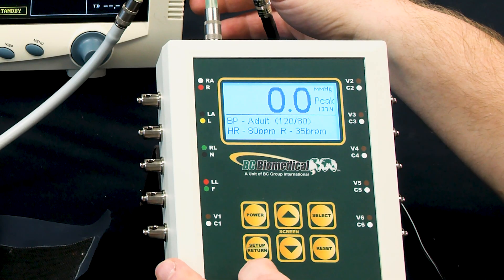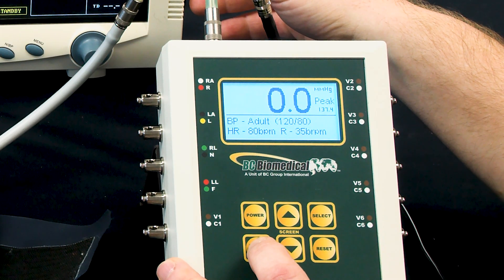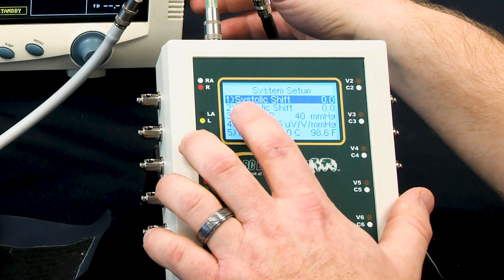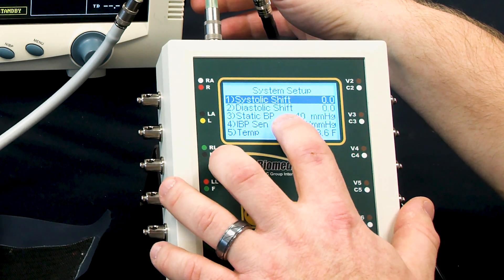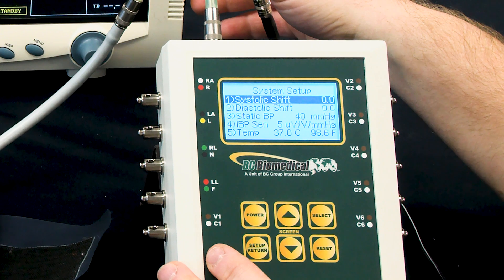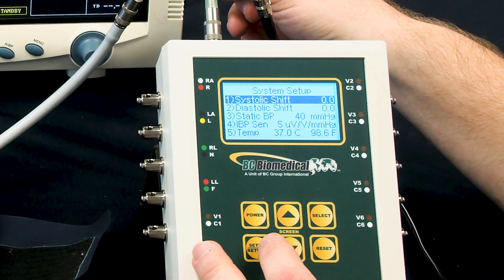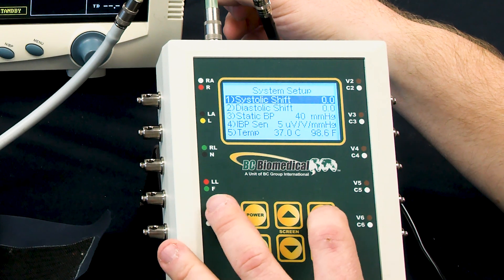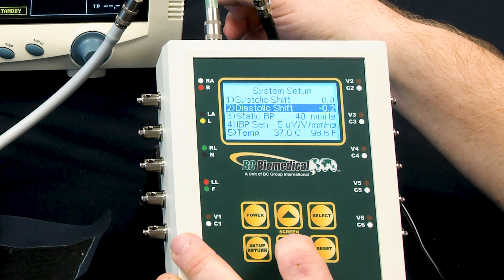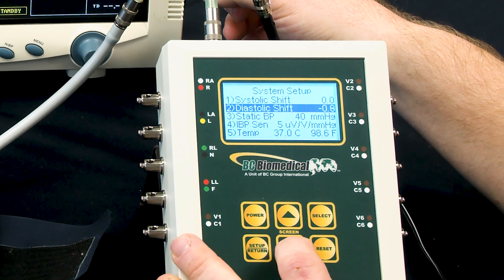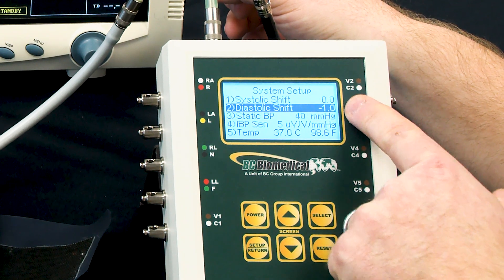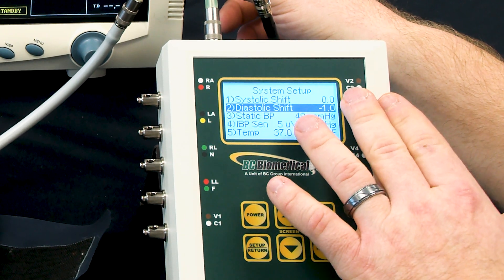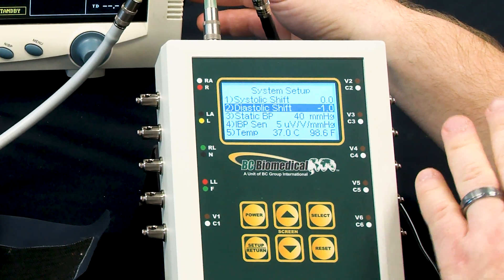It's easy to set those offsets by going into the setup menu. And in this case, we can see that the systolic and the diastolic shift are both set to zero. So if I really wanted that diastolic measurement to be exactly 80, I could go into my diastolic shift, maybe set it up for minus one. Now these measurements aren't exactly one to one, what we set in the screen here as far as adjusting the pressure.